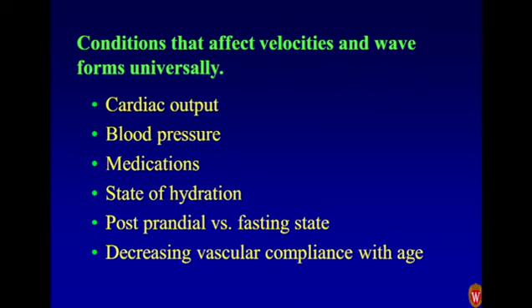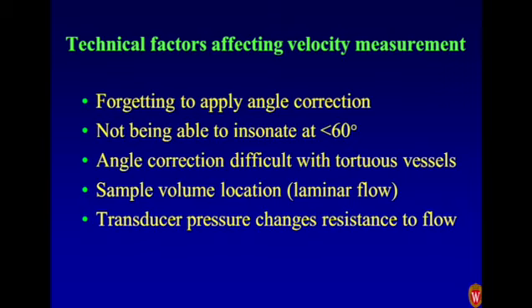That will have a great impact on venous waveforms. Whether or not the patient has been fasting is critically important in looking at the splanchnic vasculature, the superior mesenteric artery, the IMA; the velocities of portal vein will change. And if you have a patient who's older, their vessels are not as compliant. All of these factors will affect waveforms and velocities in an end organ, but really are not a manifestation of a disease process in that organ itself.